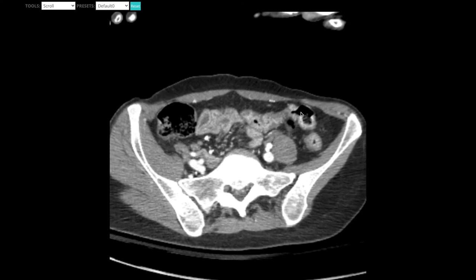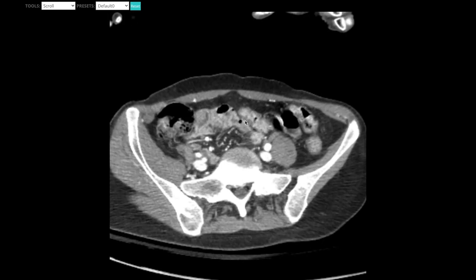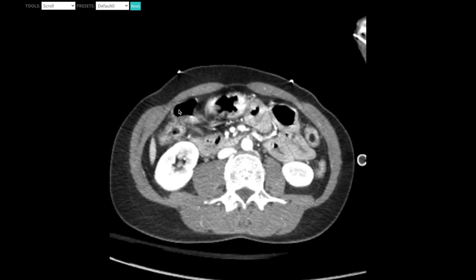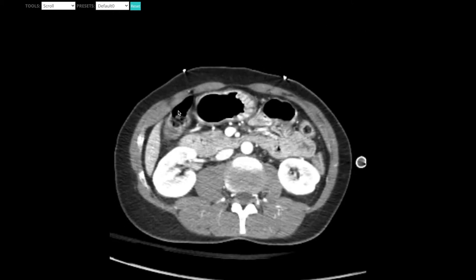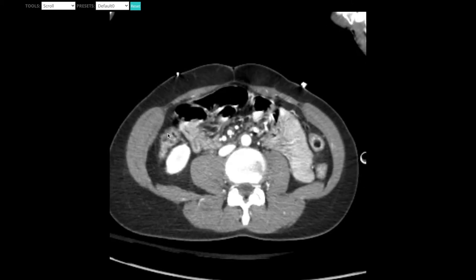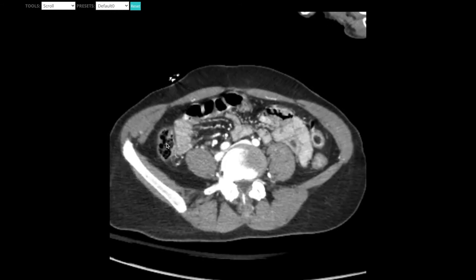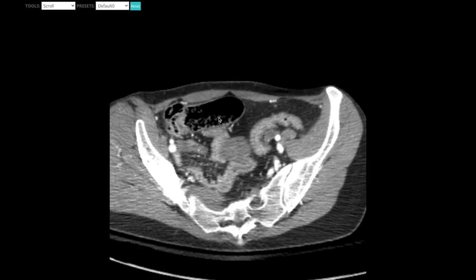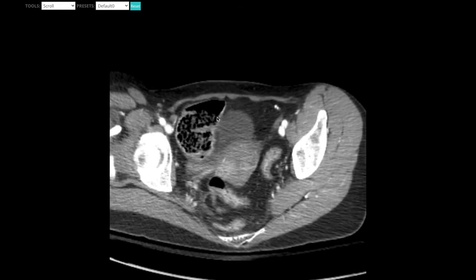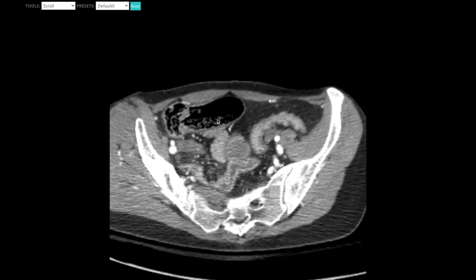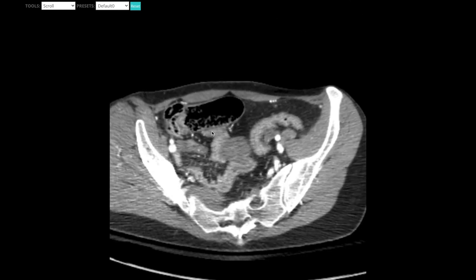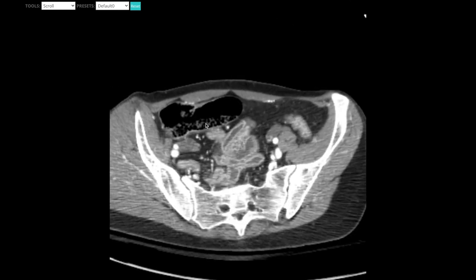Continuing down through the transverse colon, we see it go horizontal. Scrolling back up, continuing to the hepatic flexure, then scrolling back down to the ascending colon. Eventually this goes into the cecum — a big large portion of bowel. Following the ileum loop, it eventually connects right there at the ileocecal valve, and that all looks fine.